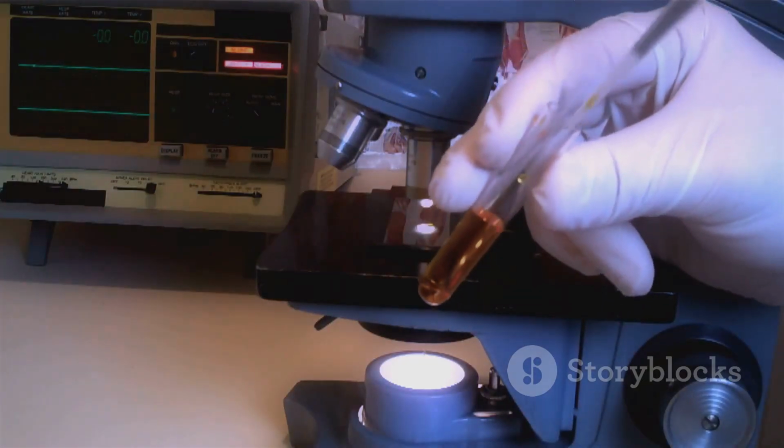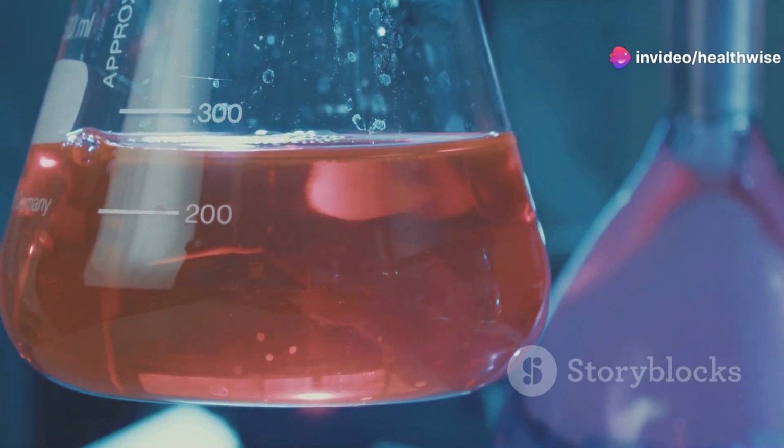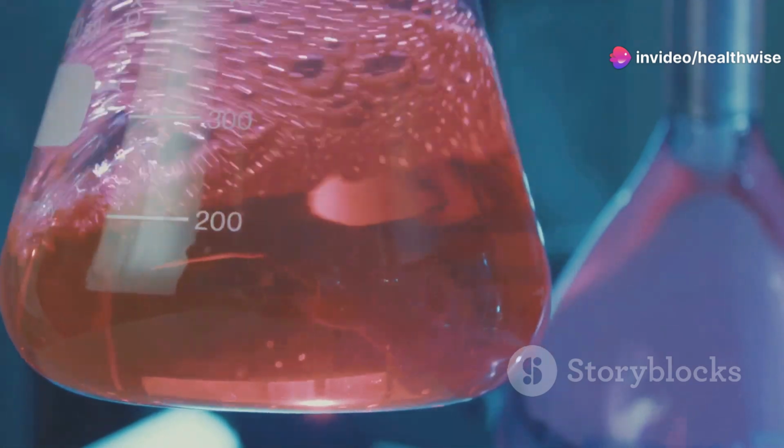Finally, let's touch on the dye binding method. While Coomassie Brilliant Blue was initially used, it stained all the glassware. Now, other dyes like Pyrogallol Red are used to measure small amounts of proteins in CSF.